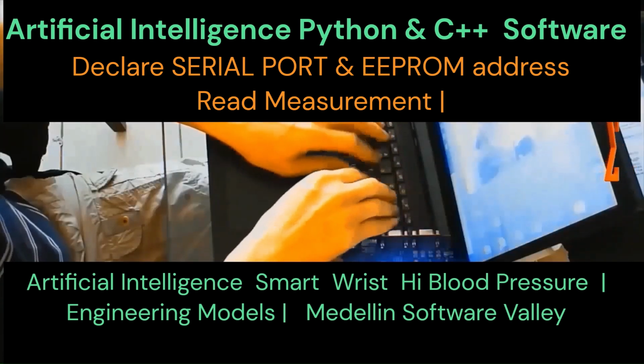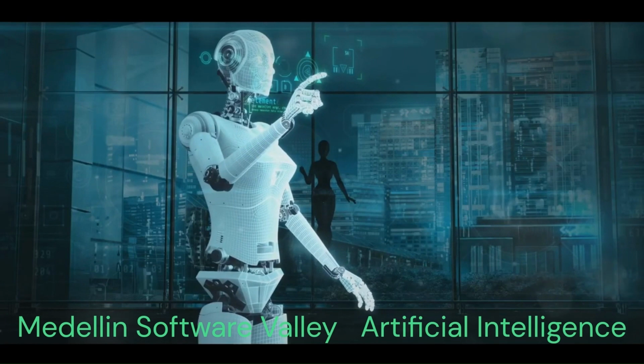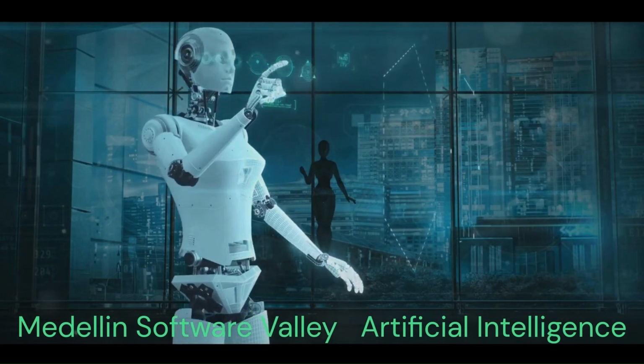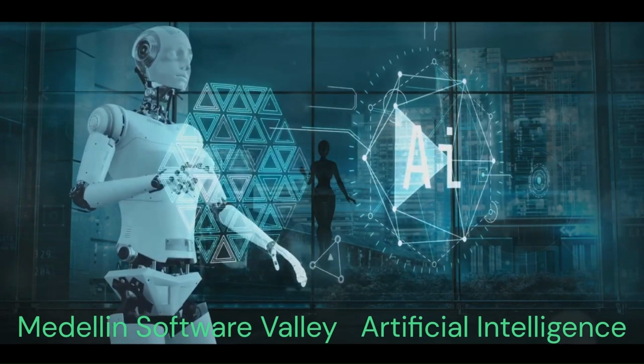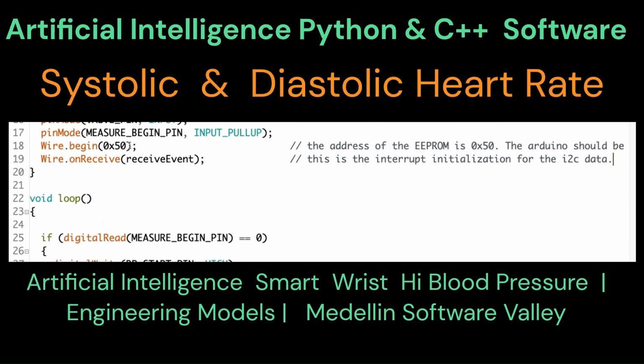The main CPU uses an Atmega 328 as the main processor and will support 8 analog input and output ports and 22 digital input and output ports. The pressure sensor driving circuit takes an ADC resolution and motor driving module for close contact between the pressure sensor and blood vessels.